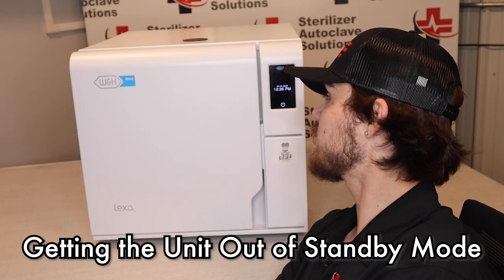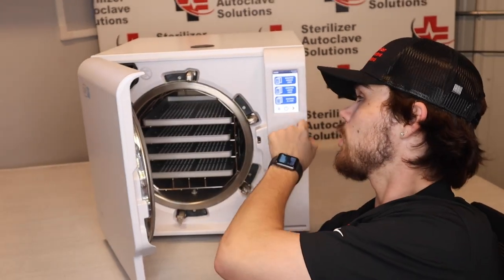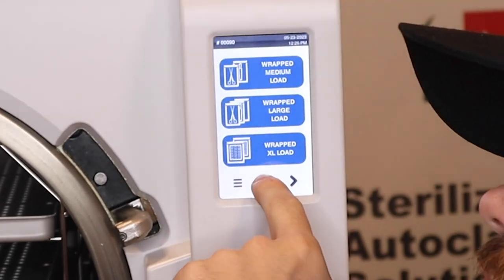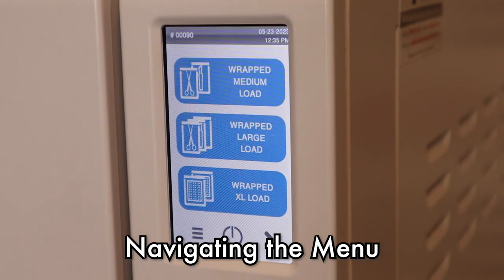First, we're going to start with how to get the unit out of standby mode. You can either pop the door open just like that, or you're going to press the power button down here in the bottom center of the screen. It puts it back in the standby. So once we have our unit woke up, this is the screen that we're going to be left with.